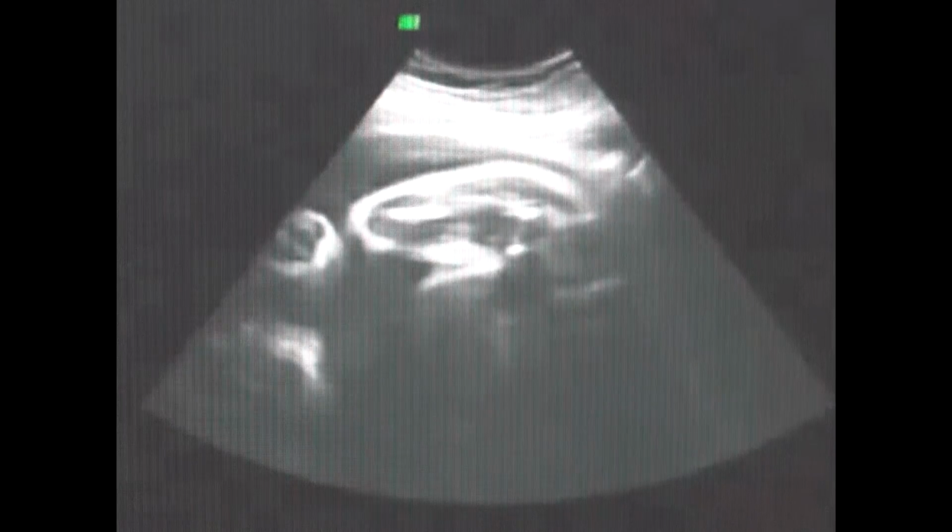Okay. Her little butt is right here. Okay, so her legs come this way. One leg. So all the moving I feel down here a lot is probably her butt. Her butt, yeah. So her little leg, one leg's here. This is actually where her little tushy is. And this is her thigh bone. And then it comes almost in front of her face. Both of her feet are actually very close to her face. We're just not catching them when we see her face. But they're actually right up here above her face. So almost even above her head.